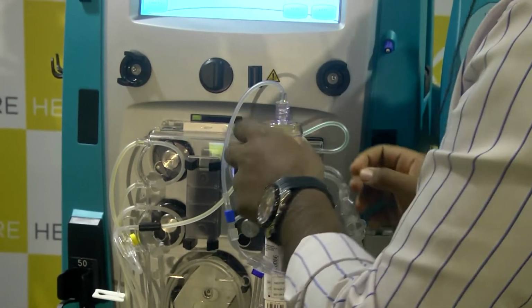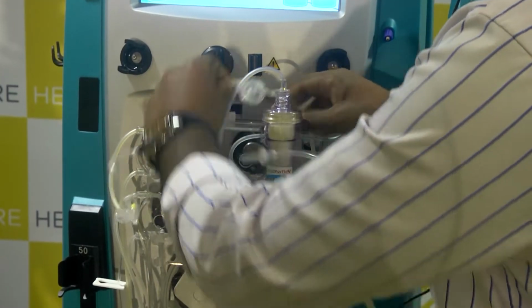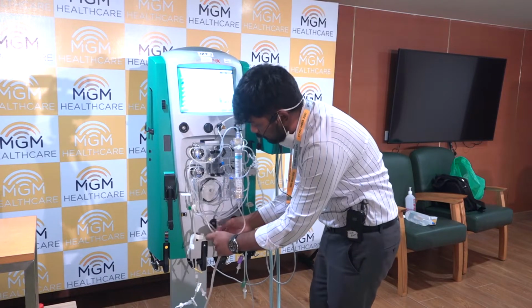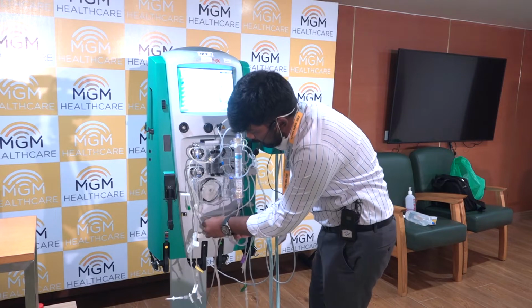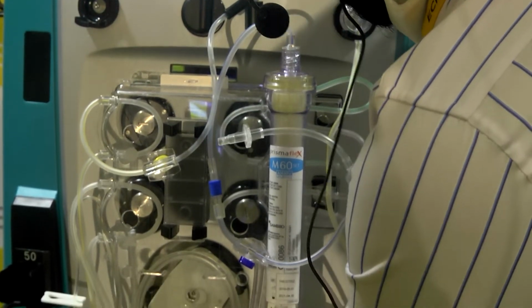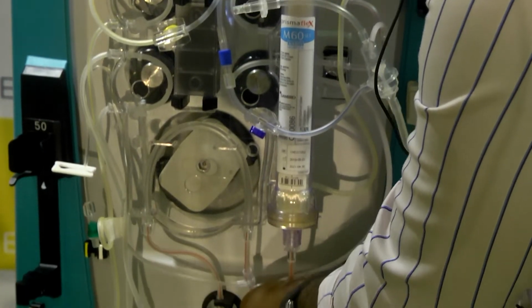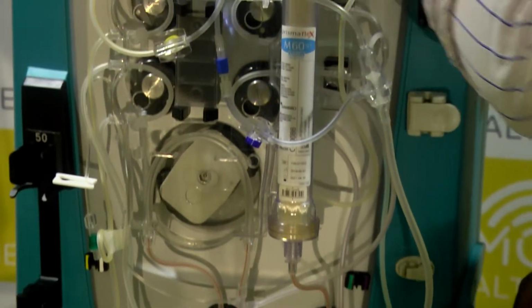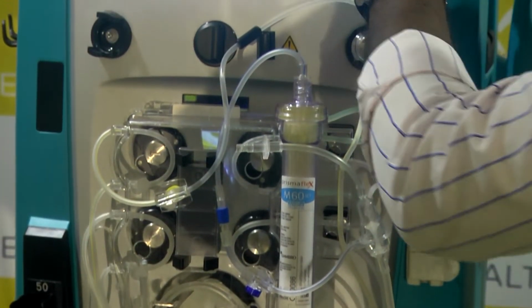It says attach all pressure pods. There are three pressure pods used in this. The first one is the effluent pressure pod, the second is the access pressure pod, and the third is the filter pressure pod. The picture also changes here so that you can see what you have to do in this step.